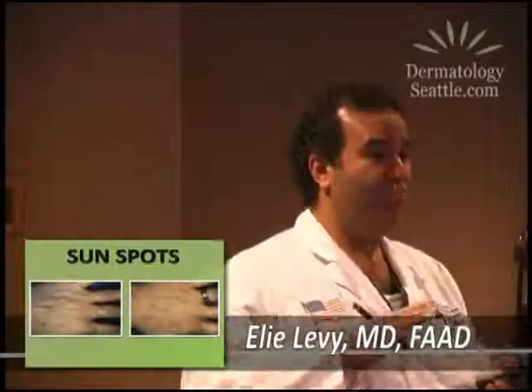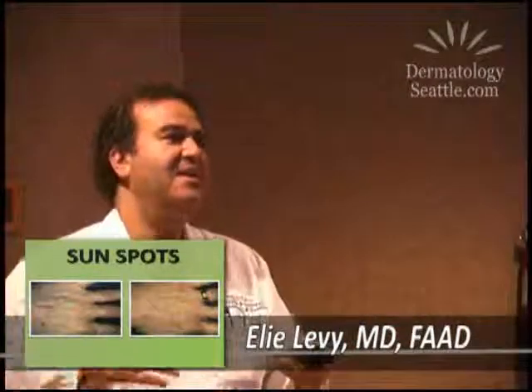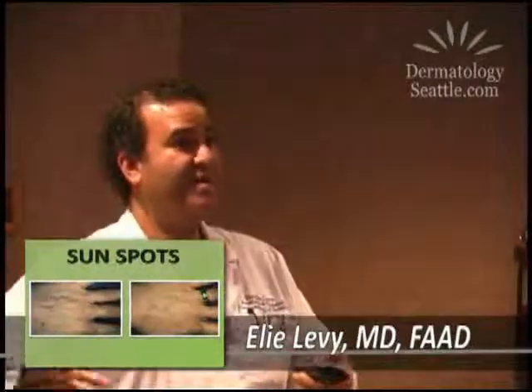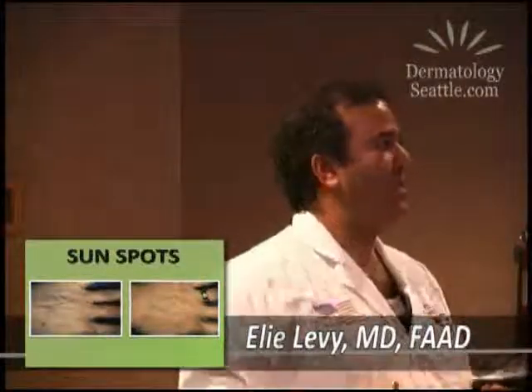We have more broad lasers nowadays. That photofacial that we were talking about before, that Michelle does, that I'll refer to my estheticians now because it's less expensive and it's more effective. Actually less expensive nowadays and more effective to use a different type of broad laser with a larger head, and it's a lot quicker treatment.